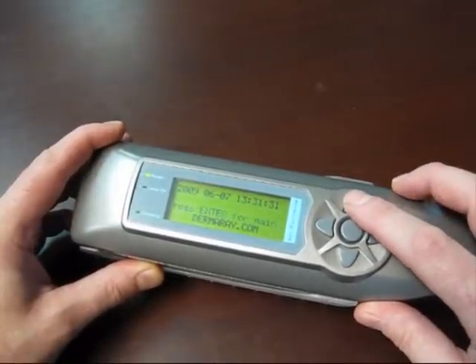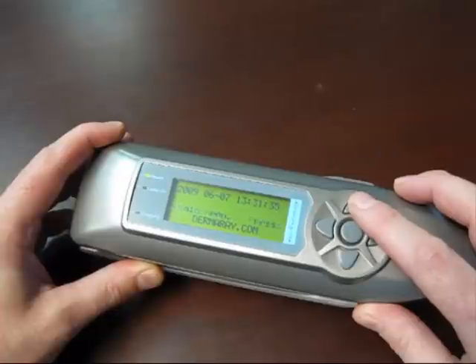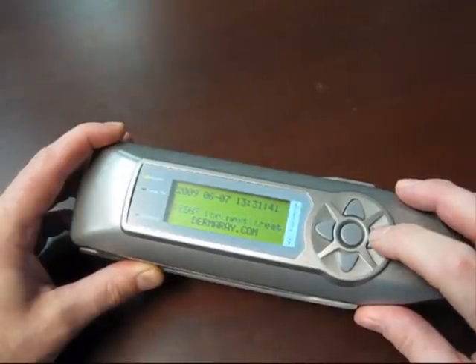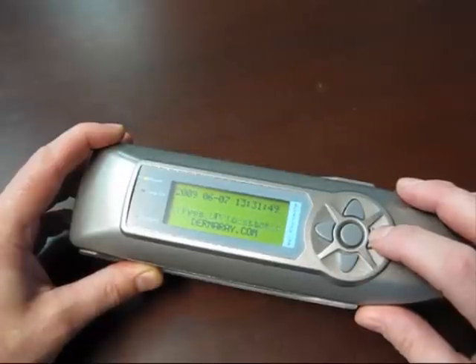The top key, if it's held down for 3 seconds, will simply turn the lamp on, and it's on until you then turn it off by hitting enter and picking cancel. Holding down the right key for 3 seconds will load the last patient's next pre-programmed automatic treatment.